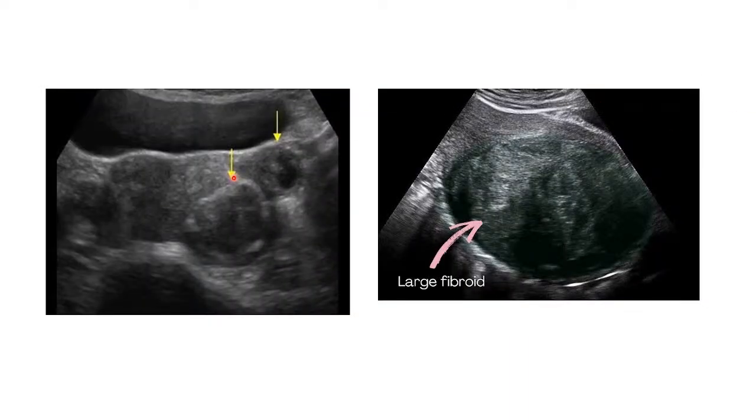Now again, here you can see that we have a fibroid, this lesion there. It has got bright margins, so this is in keeping with a calcifying fibroid. This fibroid is sort of calcified. If you look at the uterus itself, it has got issues.